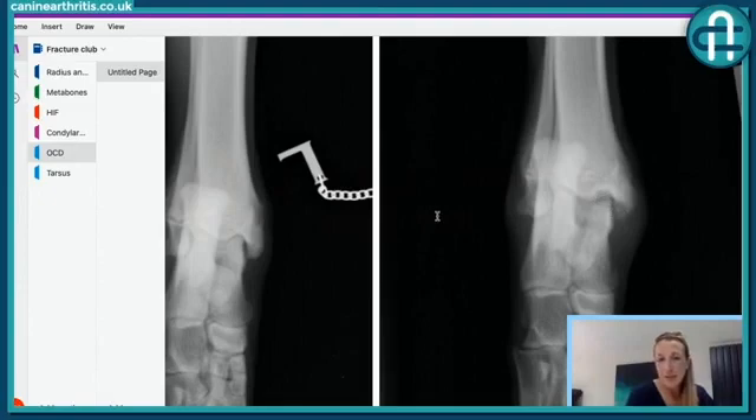We have to remember that with x-rays we can't see the articular cartilage, so it's not very often that we can actually see that flap of articular cartilage that has broken off. All we can see is that some of the bone, which at this stage in a dog should be mineralised and a dense white colour, is missing where it should be. You can also appreciate on this x-ray the increase in the amount of grey either side of the bones — that's the soft tissues — so it looks like this dog has swelling and accumulation of fluid in this joint.